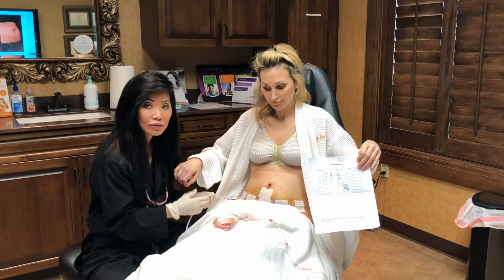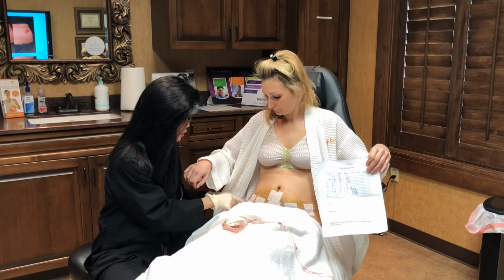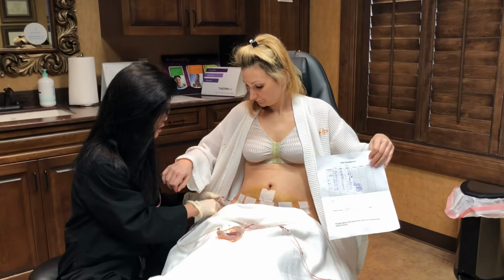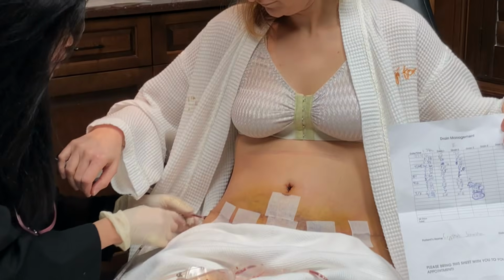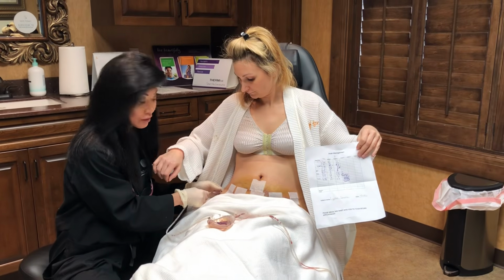When we're trying to do wound care, we want to keep the area clean. You can always put a little bit of antibiotic ointment on it, but just keep it dry and clean. We do have it sewn into place so it doesn't pull out with a little suture.